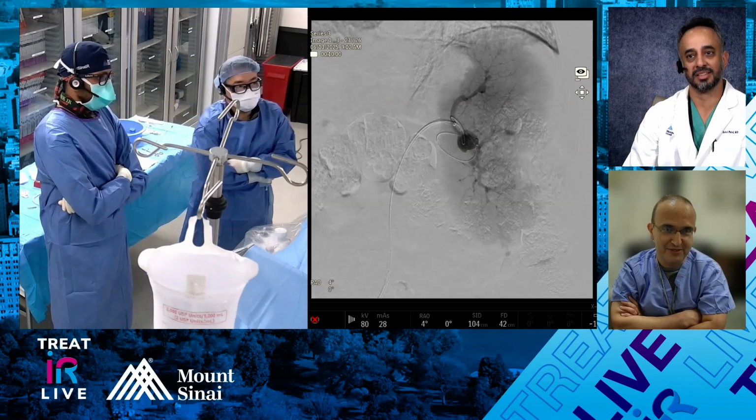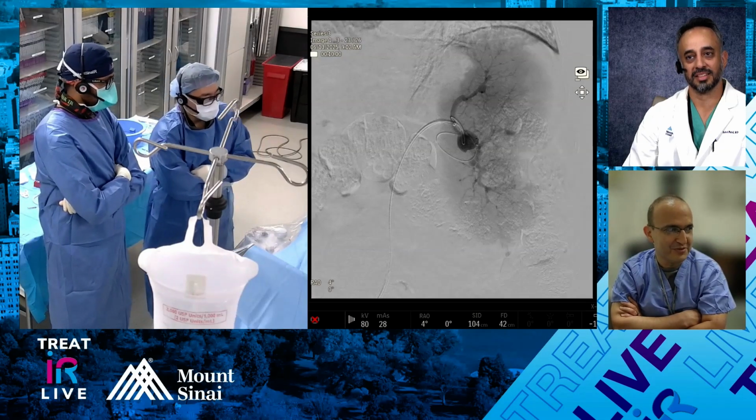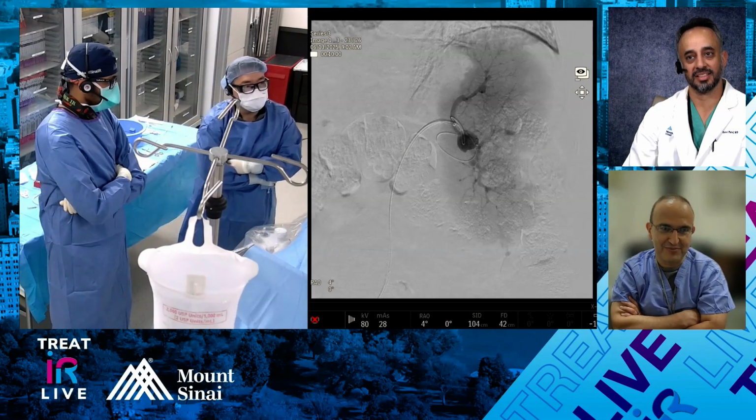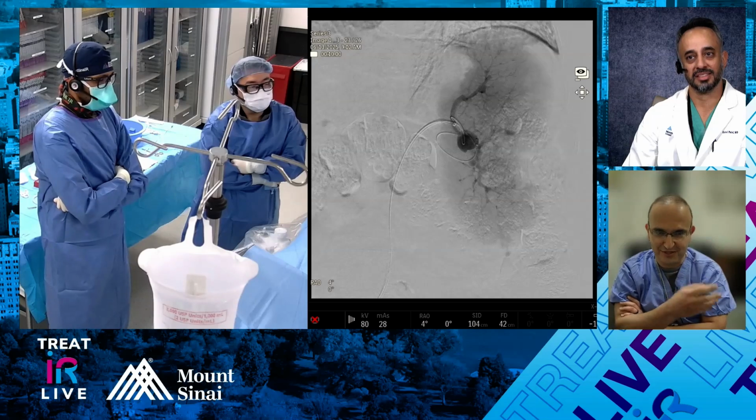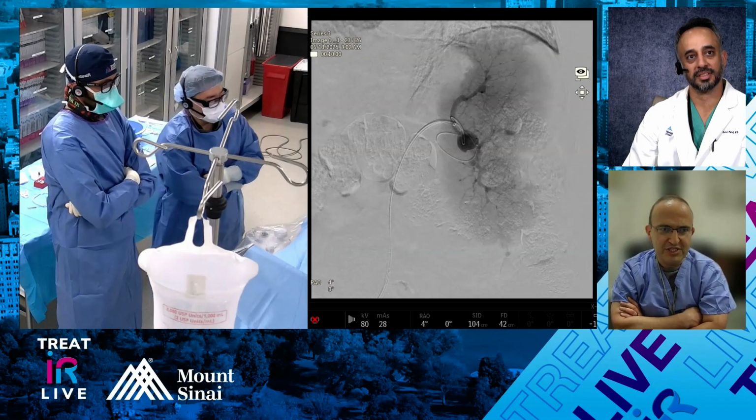I wish we got some aneurysms proximal to a stent graft. I think in our whole life we've had one case where we could put a stent graft across the proximal aneurysm. And most of the time, like you said, especially in these patients, they're in the middle of the hilum. So, yeah.